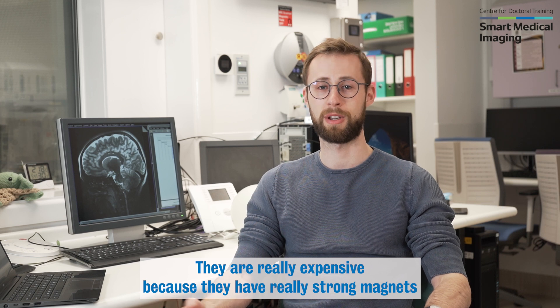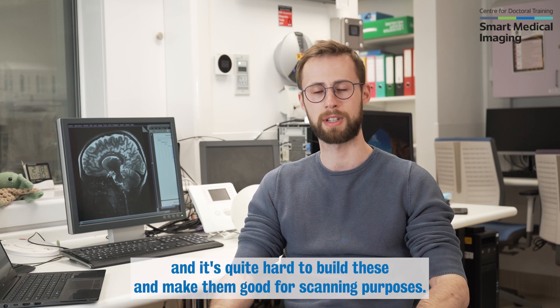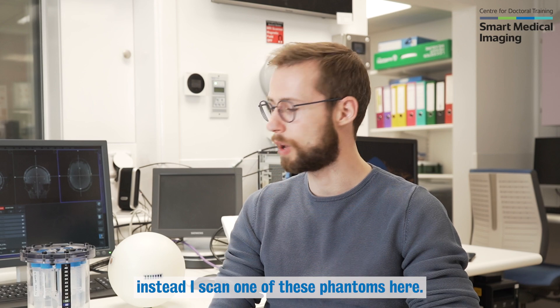They are really expensive because they have really strong magnets inside of them and it's quite hard to build these and make them good for scanning purposes. When I run my experiments, I usually don't scan humans because it would take way too long and they might move. Instead, I scan one of these phantoms here.